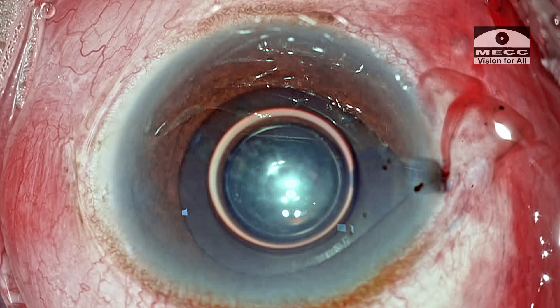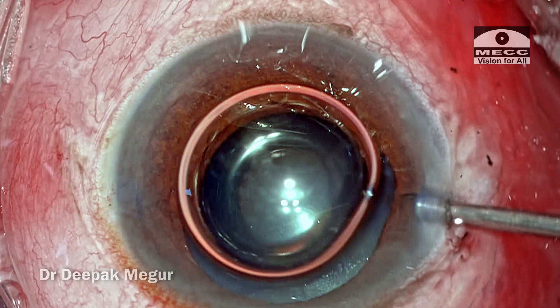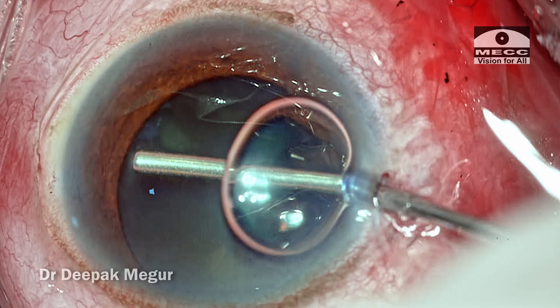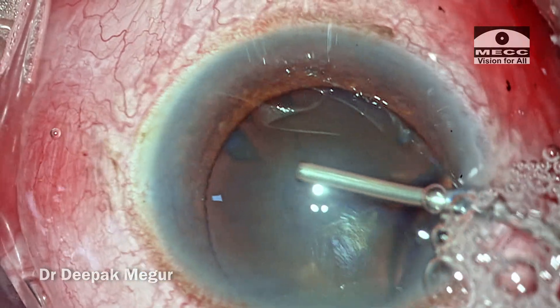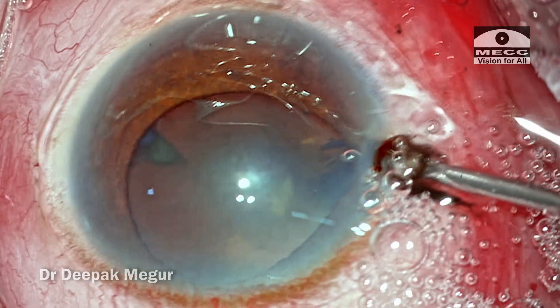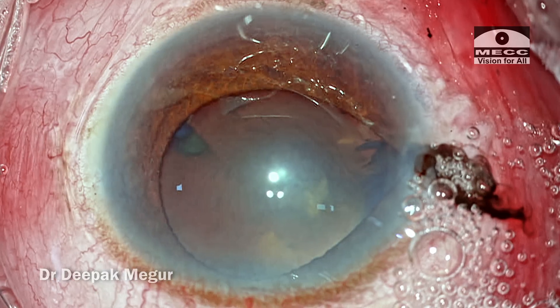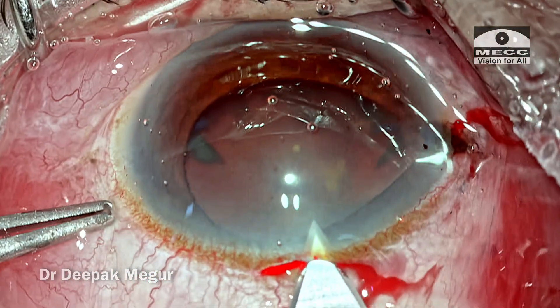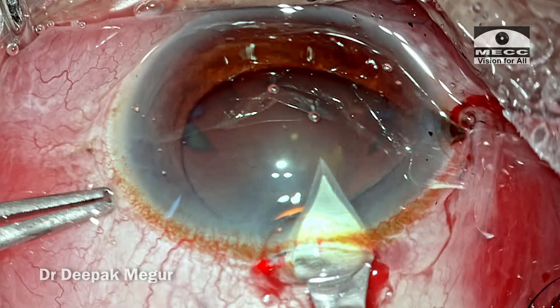What does the surgeon do now? He tries to reposition the iris a couple of times. He then thinks of pushing the viscoelastic into the eye and does so, but the iris is prolapsing out again to the side port. The surgeon is now planning to do the main incision because he is unable to push back the iris.